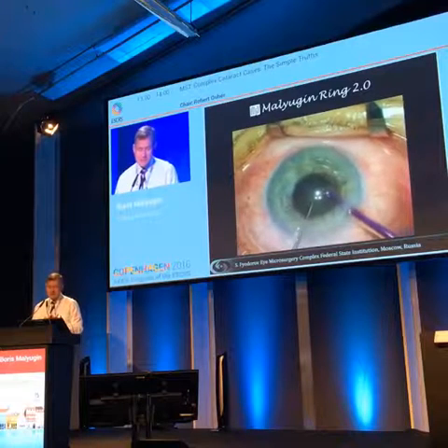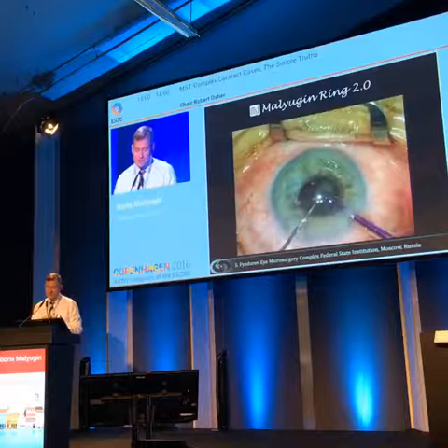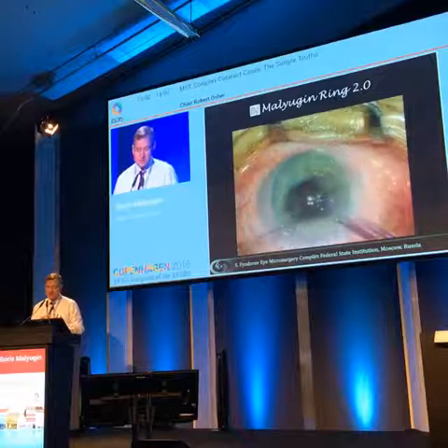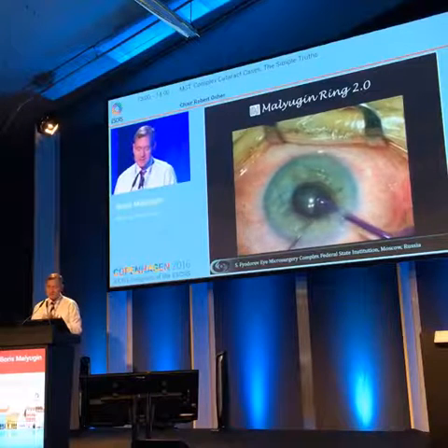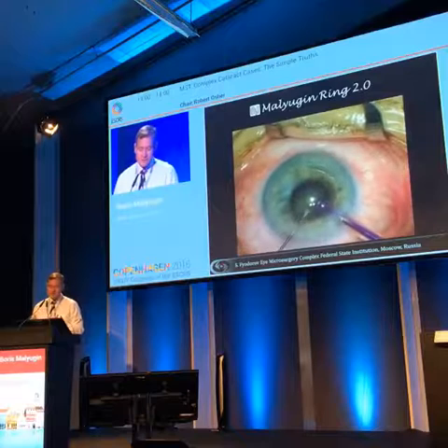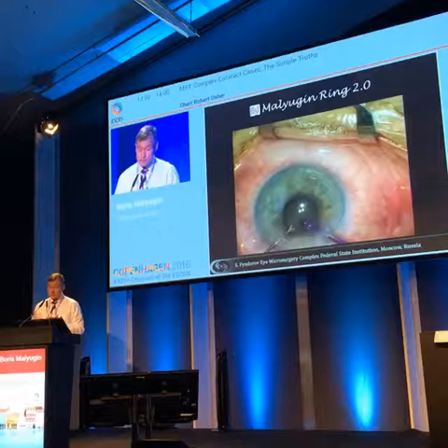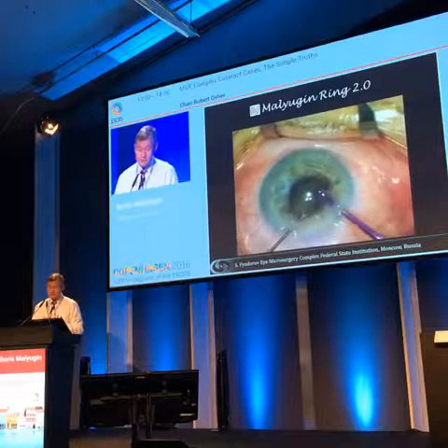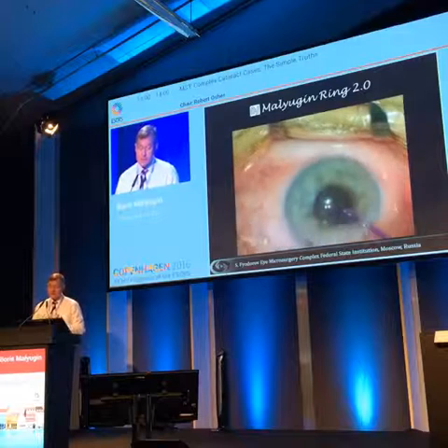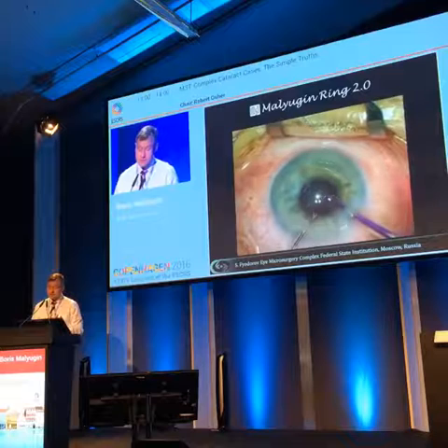I still was thinking that I would be safe enough to conquer this pupil, and by injecting viscoelastic through paracentesis, you can a little bit expand the pupil, but as you can see here, there is a constant constriction of the pupil throughout the procedure. That was definitely the result of this intraoperative floppy iris syndrome combined with laser generating prostaglandins in the anterior chamber.